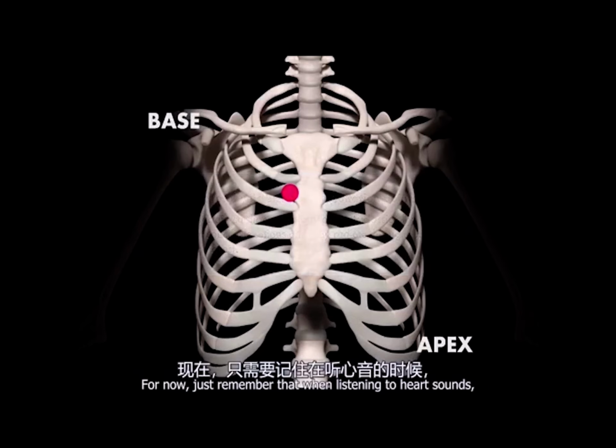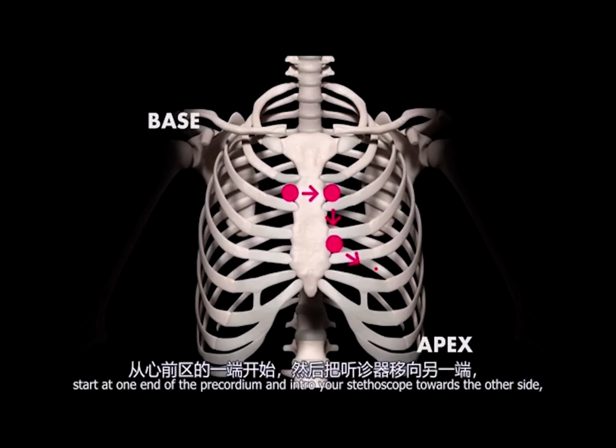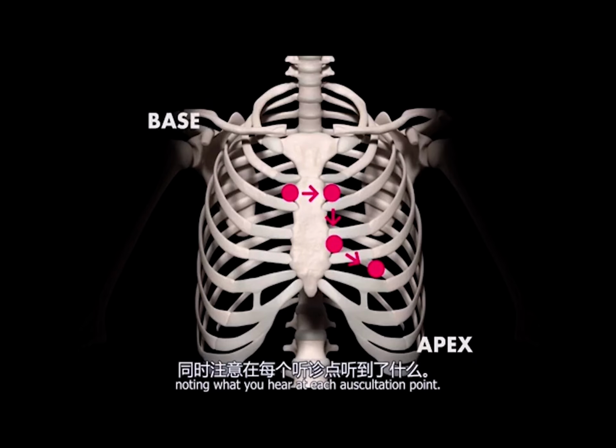For now, just remember that when listening to heart sounds, start at one end of the precordium and inch your stethoscope towards the other side, noting what you hear at each auscultation point.